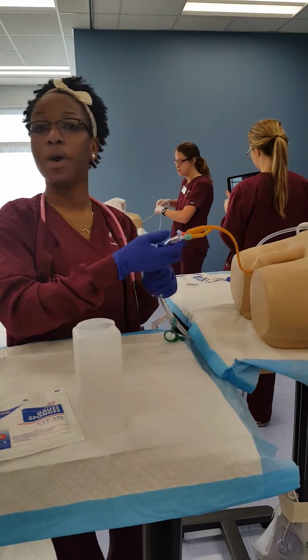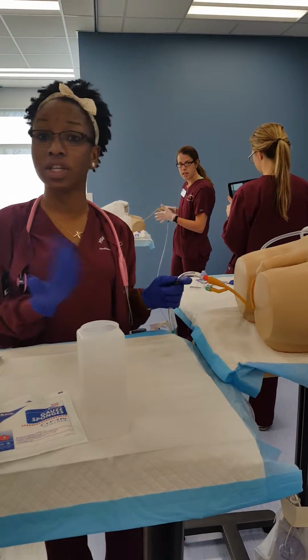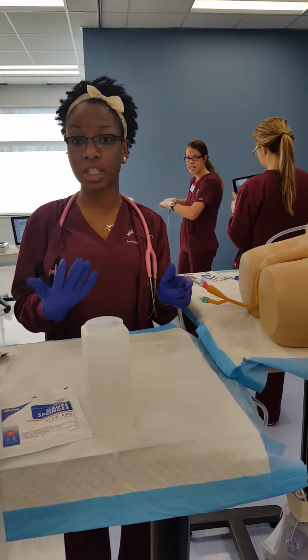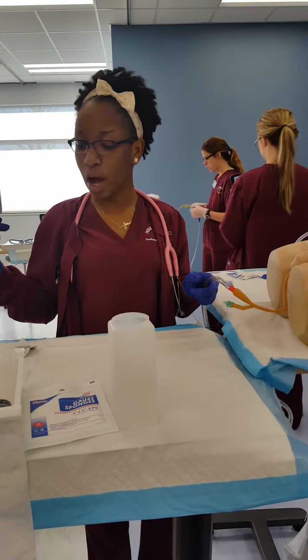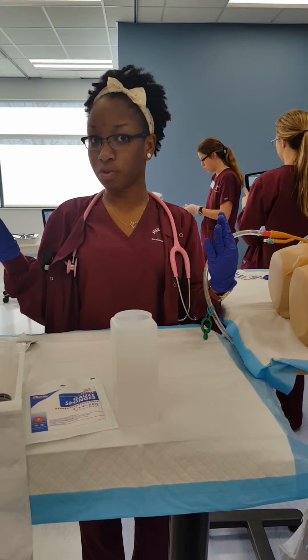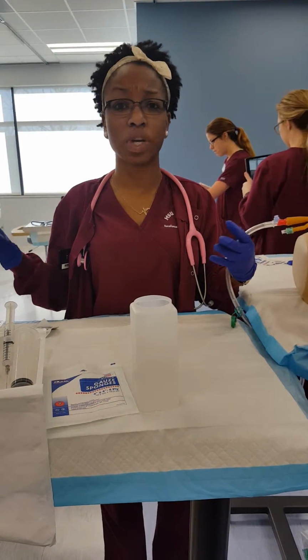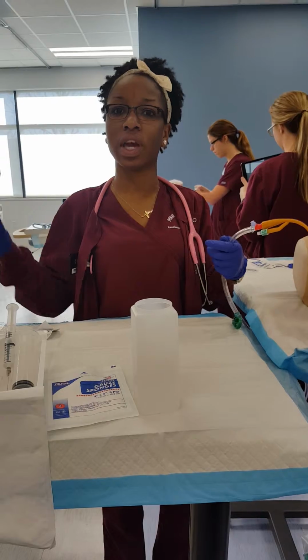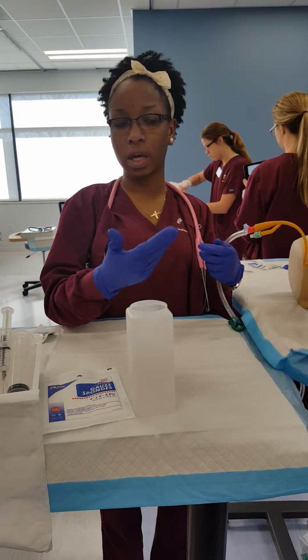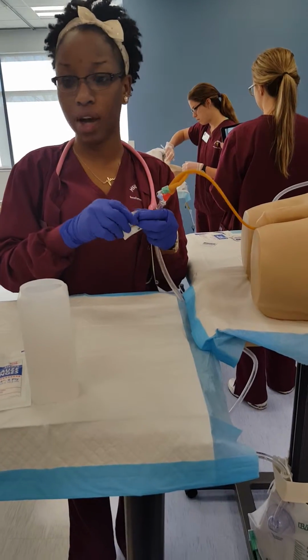Alright, now I'm going to administer my medication, gentamicin. I have told the patient the side effects that they might have, such as dizziness or orange urine. I'm going to change my gloves, put on a new pair, and this can be a clean procedure since I'm not opening anything. But I still have to clean with my alcohol swab.